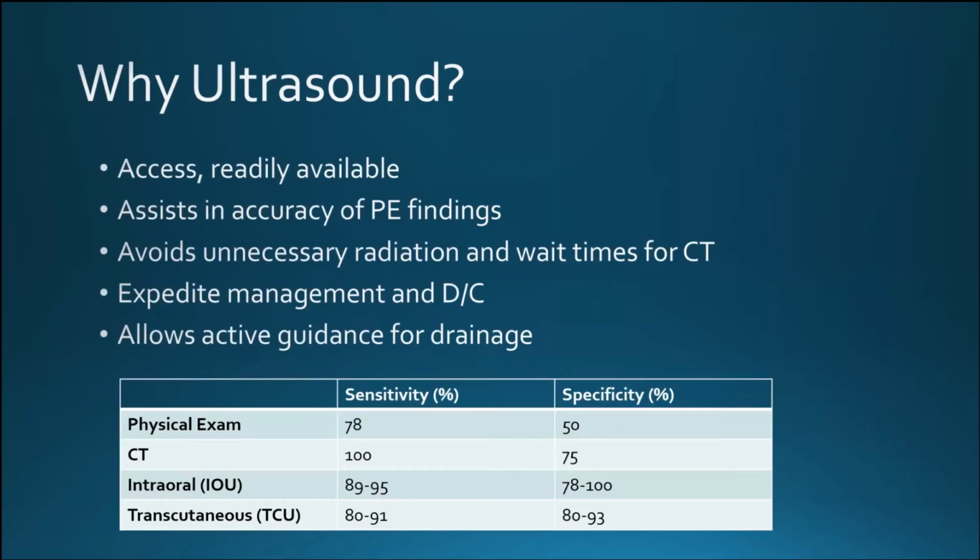Because this is an ultrasound interest group, of course I'm going to focus on the ultrasound, but there are some other imaging modalities and physical exams that people use to approach draining some of these at times. If you look at the bottom here, I showed the sensitivities and specificities for physical exam in diagnosing and treating this, in comparison to CT, and then using an intraoral ultrasound probe or a transcutaneous approach. As you can see, just by physical exam, the sensitivity and the specificity are rather low.